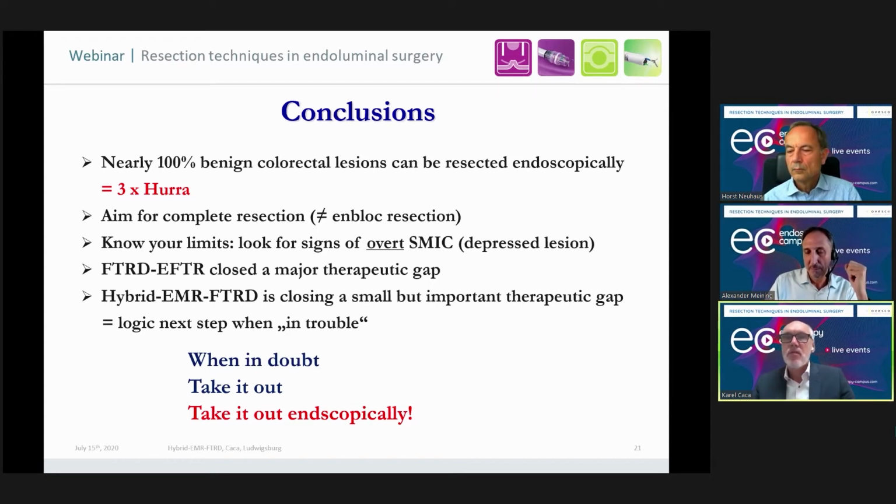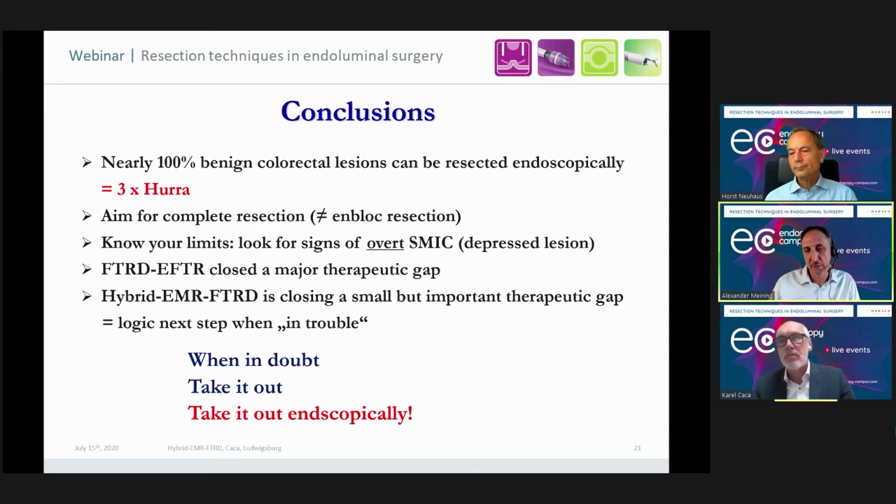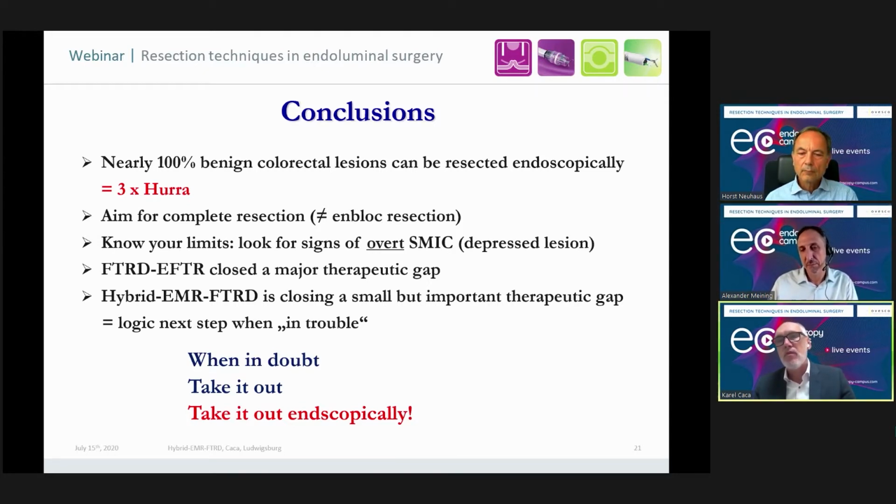I think it all depends how far down in the rectum you are. If you're above the peritoneal line, then it's easy, because then it's flexible. Then you can grasp it in and pull it in. And the further down you come, the more it's tight to the pelvic floor, and so you cannot pull it in, and all you get is a deep submucosal. So in the deep rectum, I wouldn't go for FTRD. Up to 5 centimeters, I never go for FTRD. Even if you do an endoscopic full thickness resection with a dual knife or whatever knife you use, there are hardly any complications, because the rectum is very forgiving.